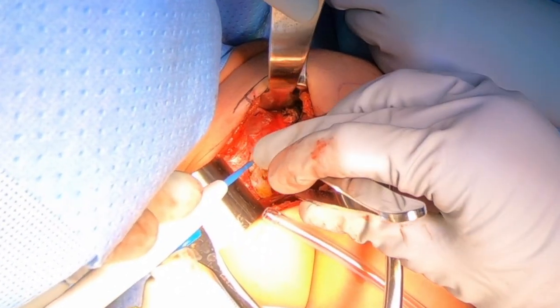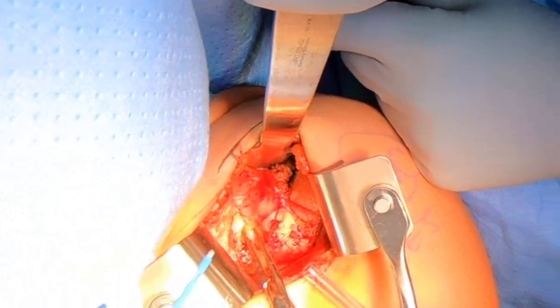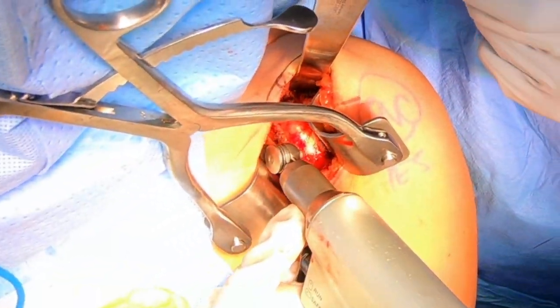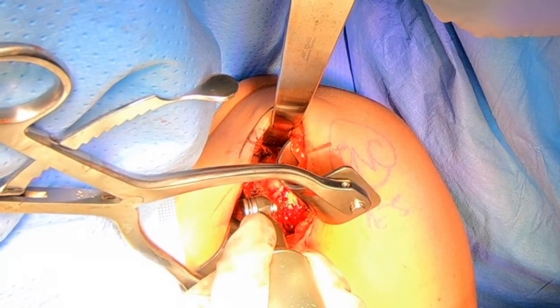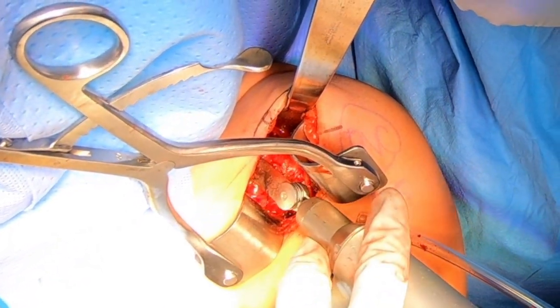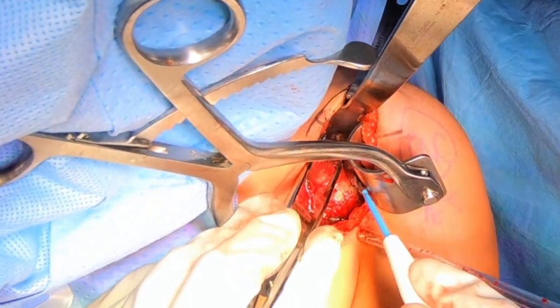You'll see me here carefully dissecting layer by layer. We have to cut another muscle attached to the inside of the coracoid called the pectoralis minor, and you'll see me carefully dissecting and then cutting it with electrocautery to make sure we have full access to the coracoid. Now we're ready to cut the coracoid off to create what's called a coracoid osteotomy. We'll use a 90-degree bent saw blade to do that, creating that osteotomy while carefully protecting all the nerves beneath. Once we make that osteotomy, you can see the coracoid can move and we can flip it up and make sure it's totally freed to move it down to the front of the socket.